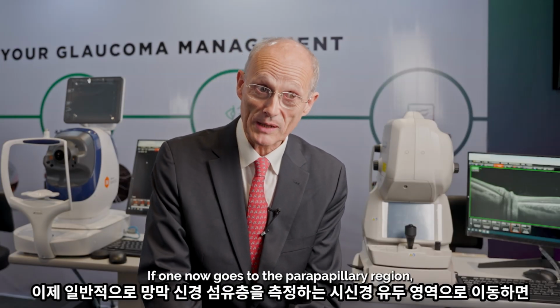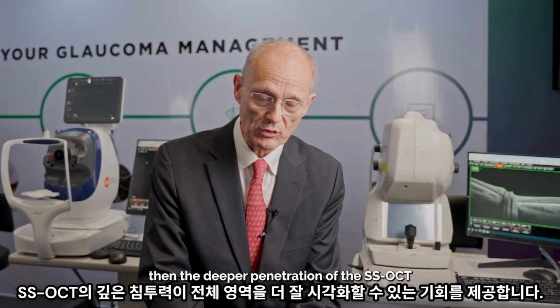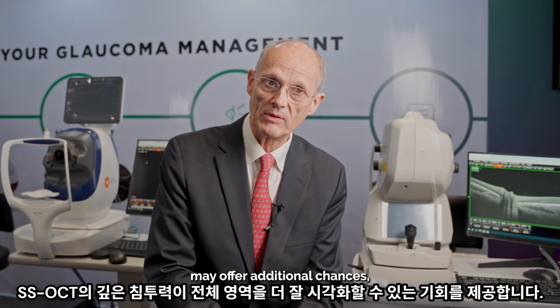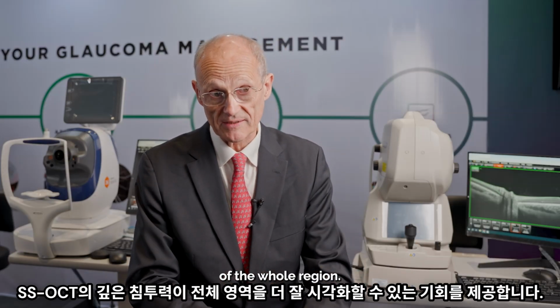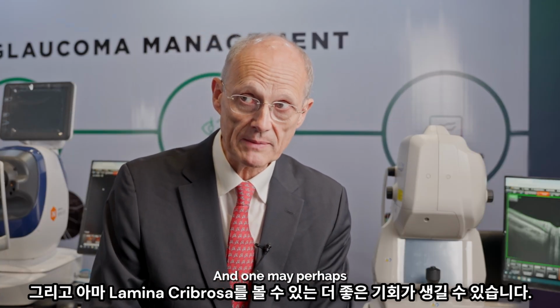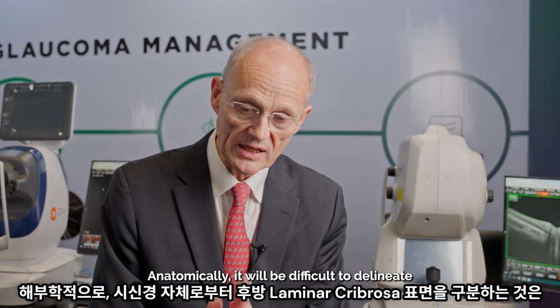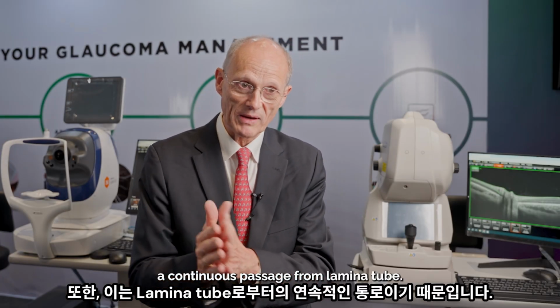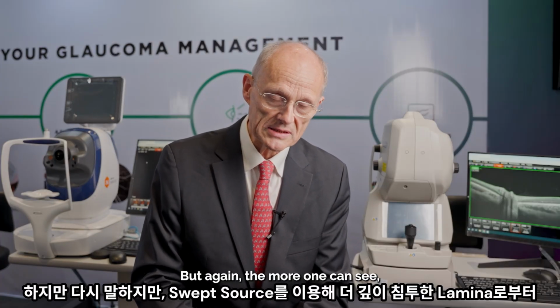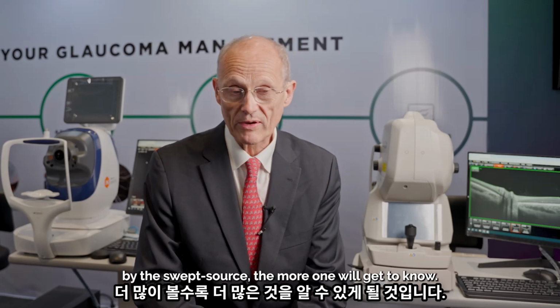If one now goes to the parapapillary region, where one normally measures the retinal nerve fiber layer, then the deeper penetration of the SS-OCT may offer additional chances also to have a better visualization of the whole region. And one may perhaps also have a better chance to see the lamina cribrosa. Anatomically, it will be difficult to delineate the posterior lamina cribrosa surface from the optic nerve itself, also because it's more or less a continuous passage from the lamina. But again, the more one can see of the lamina with a deeper penetration by the swept source, the more one will get to know.